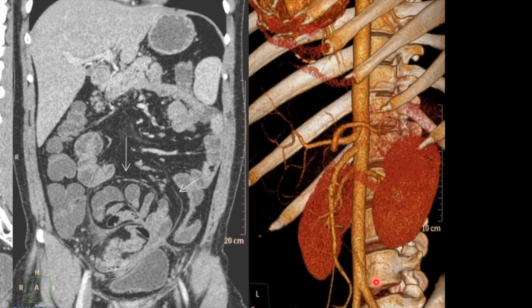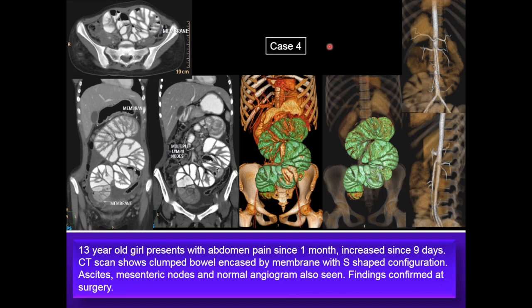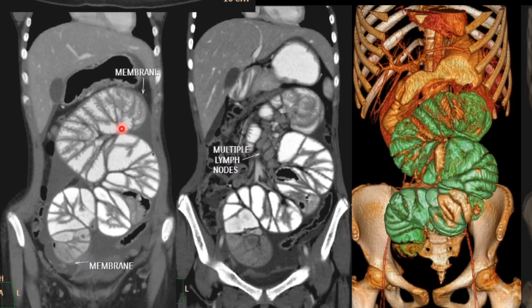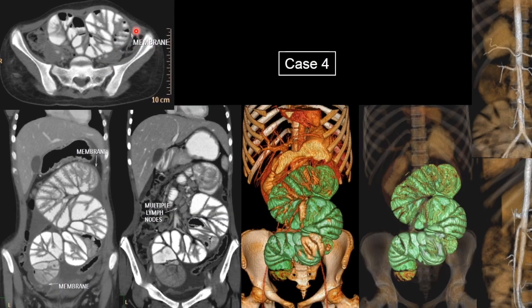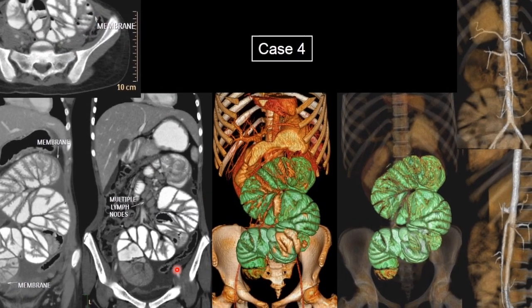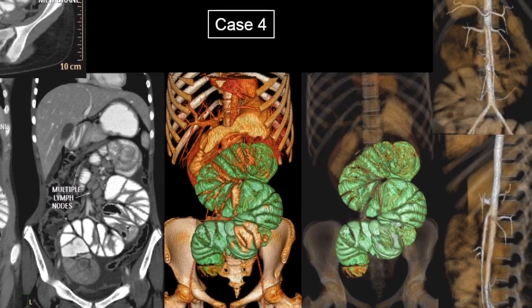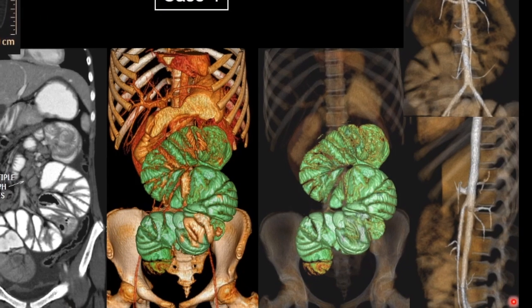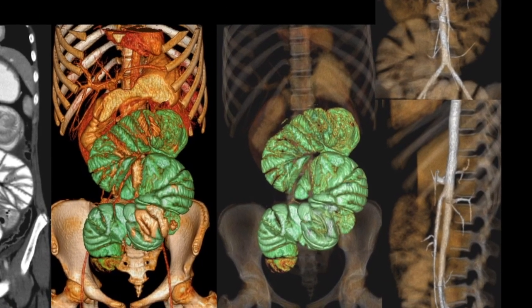Angiography is needed to differentiate from other differential diagnoses of clumped abdominal bowel loops such as malrotation and other entities which may show abnormality on CT angiography. The fourth case is a 13 year old girl who presented with abdominal pain for 1 month, increasing over the last 9 days. CT scan shows multiple bowel loops encased by a membrane producing an S-shaped configuration, with inflammatory changes, signs of peritonitis and multiple mesenteric nodes. The angiogram was normal and findings of cocoon were confirmed at surgery.